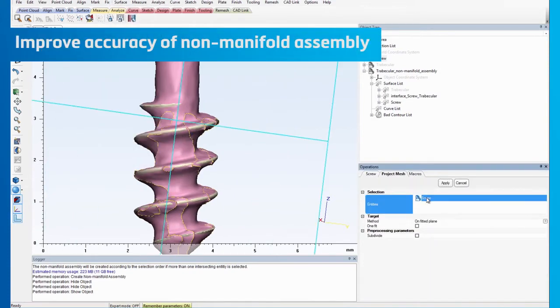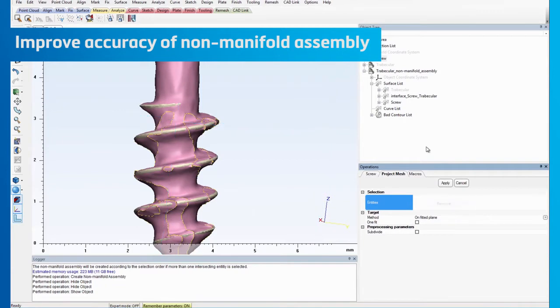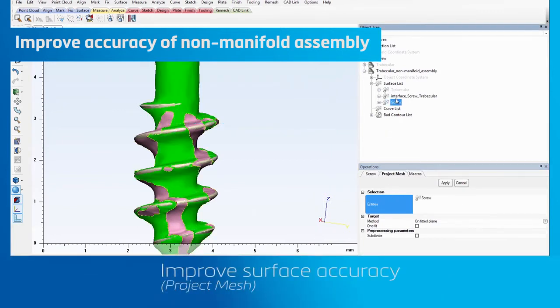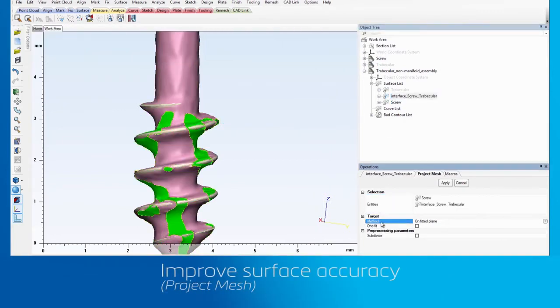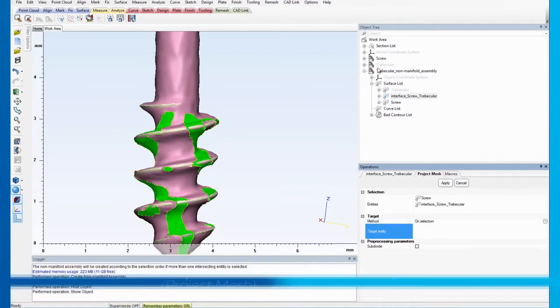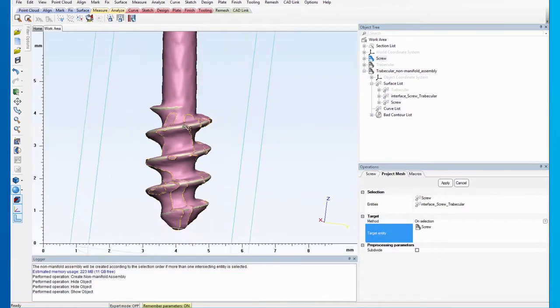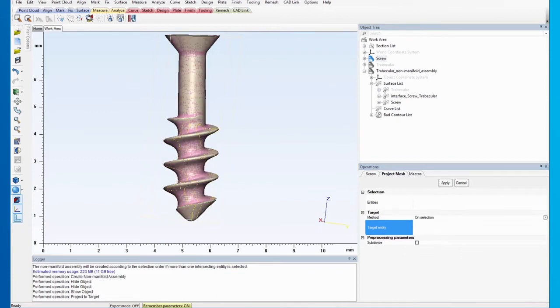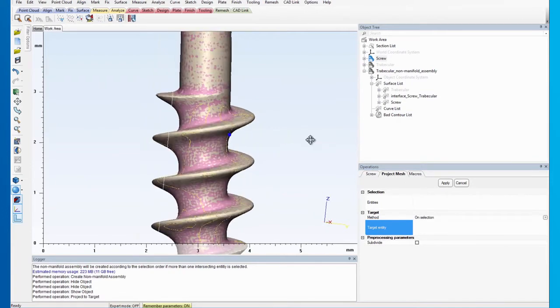We can achieve this by using the Project Mesh operation in the Fixed menu. We will then project the meshes of the interface and screw surface sets to the original screw part. The result is a noticeably more accurate screw.